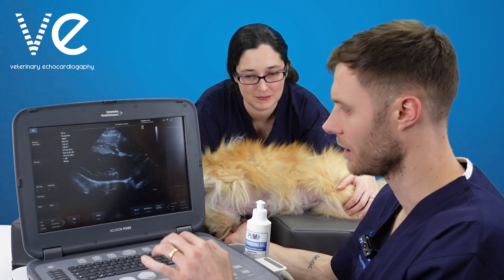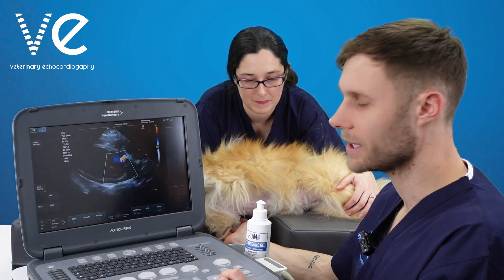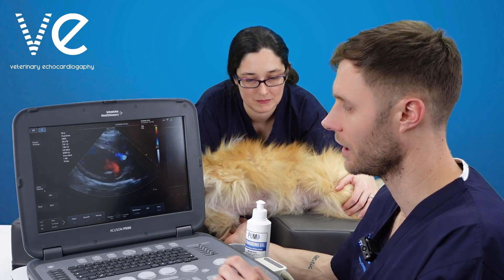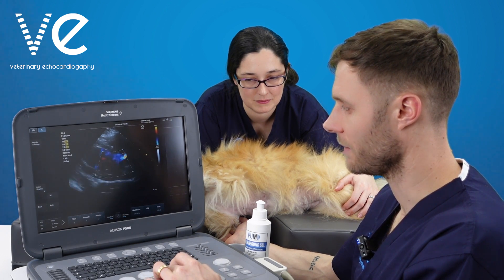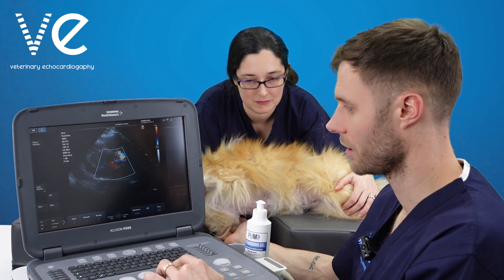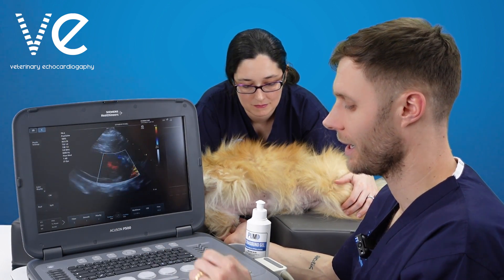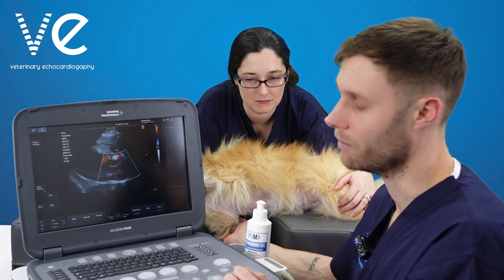Once you've optimised your 2D image, hit the colour box on. You want to keep your colour box as small as possible, while still keeping in the whole area of interest. If I make my colour box the whole of the screen, that drops my frame rate to 13 frames per second and it's quite jumpy. As soon as I reduce the size of my colour box, the frame rate increases to 21 frames per second. I can optimise this further by reducing the sector width of my 2D image to increase the frame rate even more.